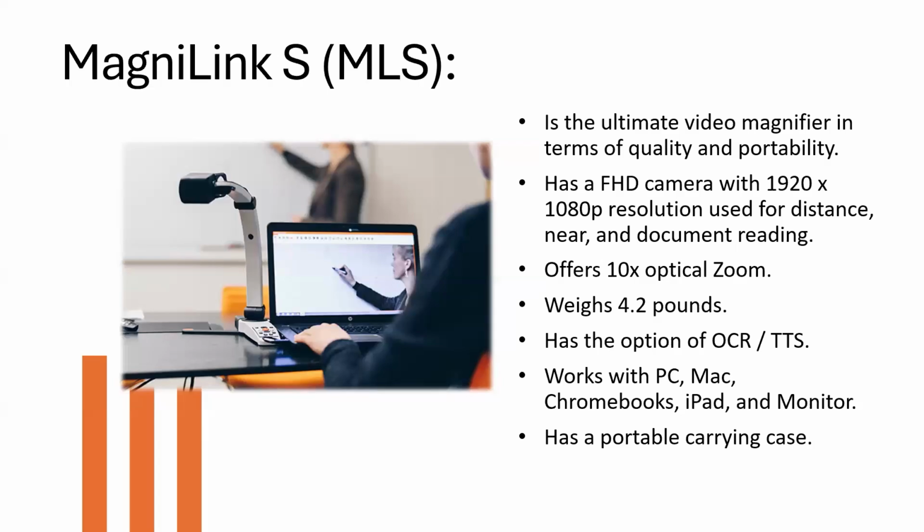So that's why we wanted, if people already had an MLS, we wanted you to be able to use it with the iPad, and that's why we do sell just the stand for the iTab product in case you want to use the MLS camera that you have.